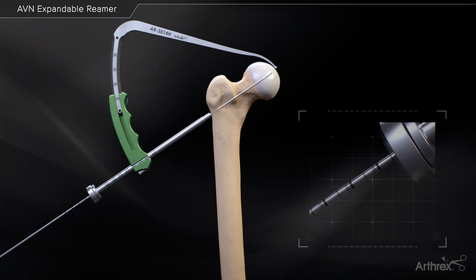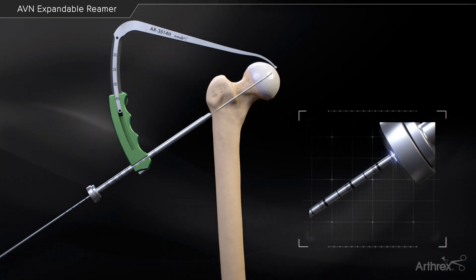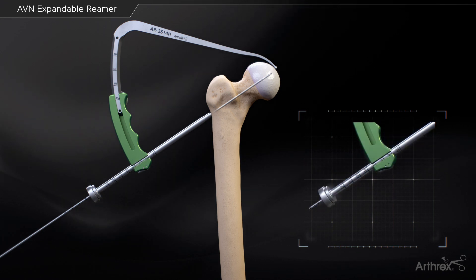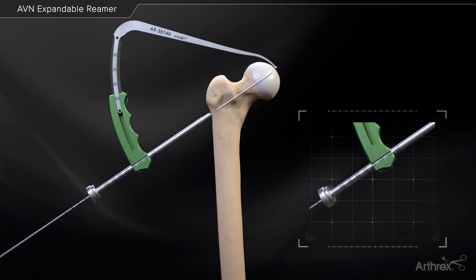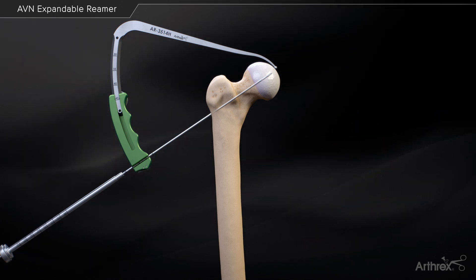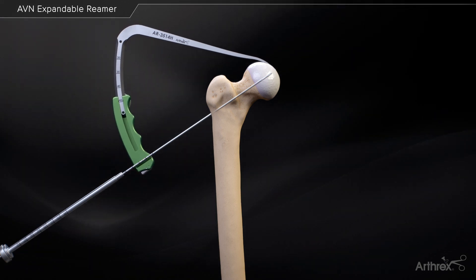Reference the drilling depth of the 2.4 mm calibrated guide pin from the back of the 2.4 mm drill sleeve insert. Press the release button on the drill guide handle and slide the 2.4 mm and 5 mm drill sleeves backwards, enough to remove the drill guide handle and marking hook.